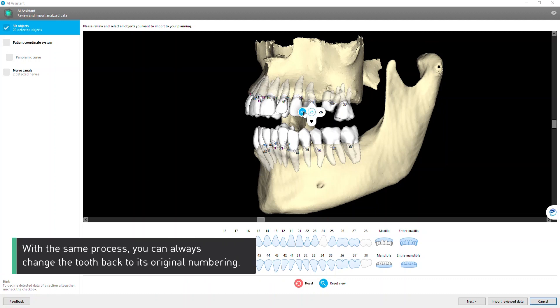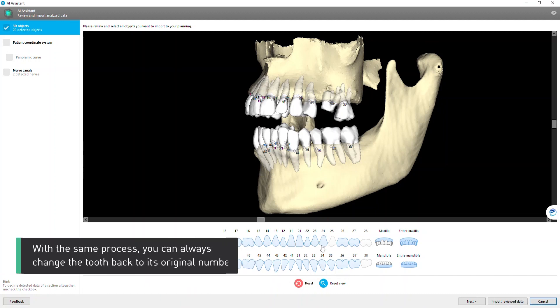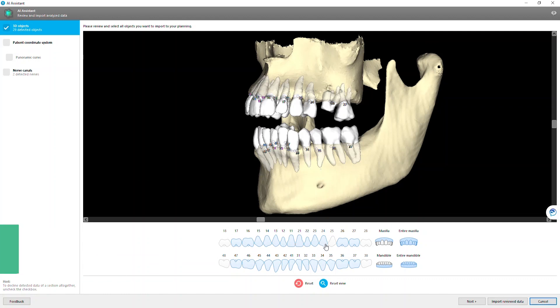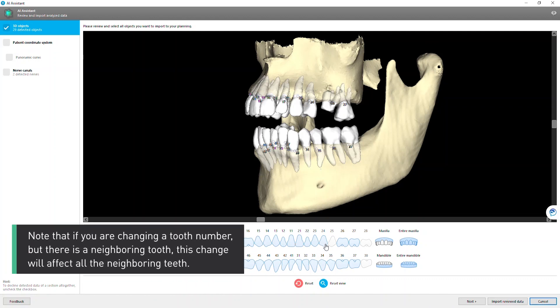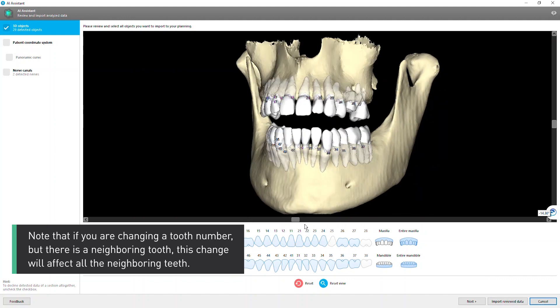With the same process, you can always change the tooth back to its original numbering. Note that if you are changing a tooth number and there is a neighboring tooth, this change will affect all the neighboring teeth.